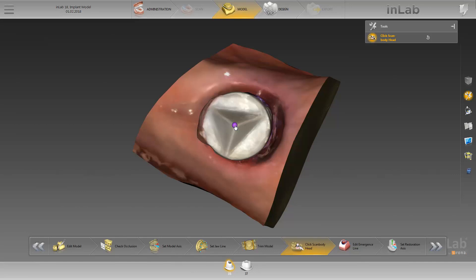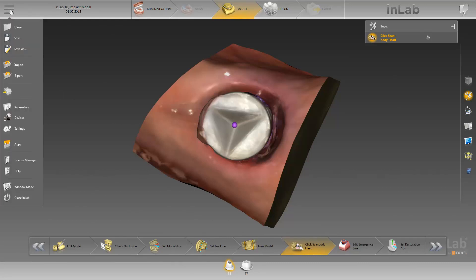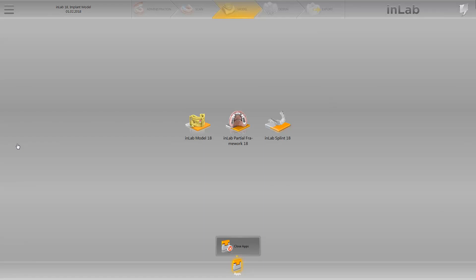This is a prerequisite to later add an implant analog in the model app. Next, we start creating the models. We open the system menu, click on the option apps, and then on in-lab model 18.